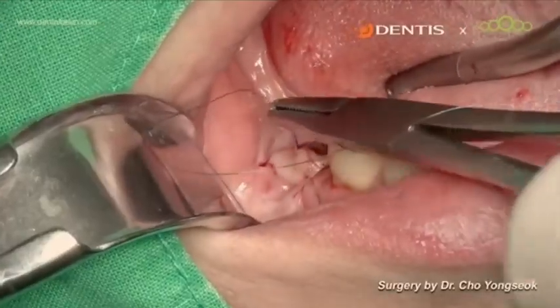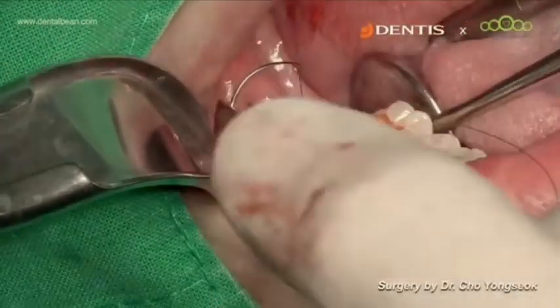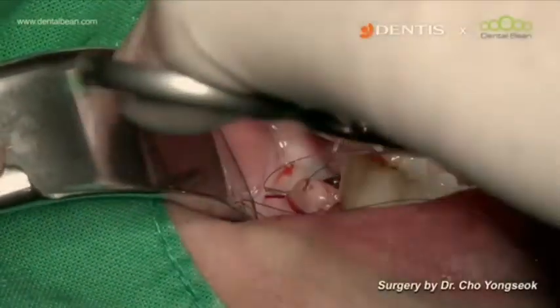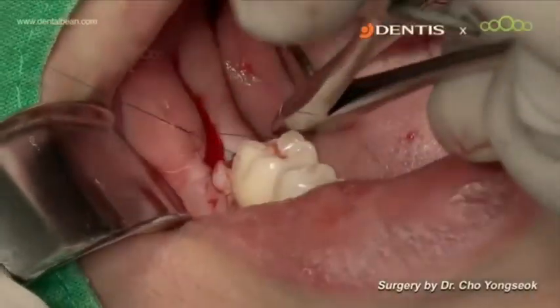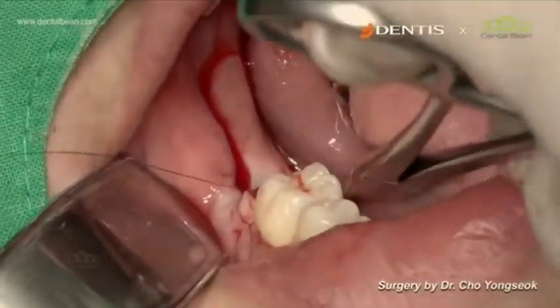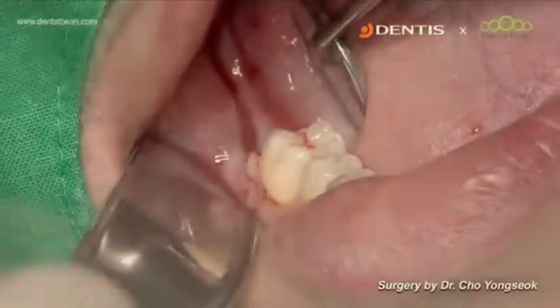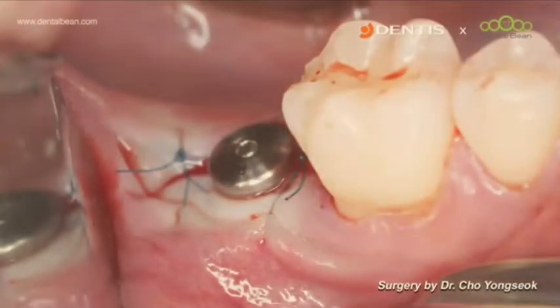Okay, one more modified external vertical mattress suture. After finishing, press the buccal flap with your fingers and it will be like this.